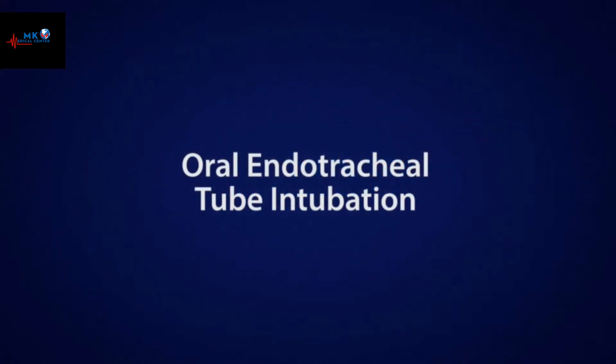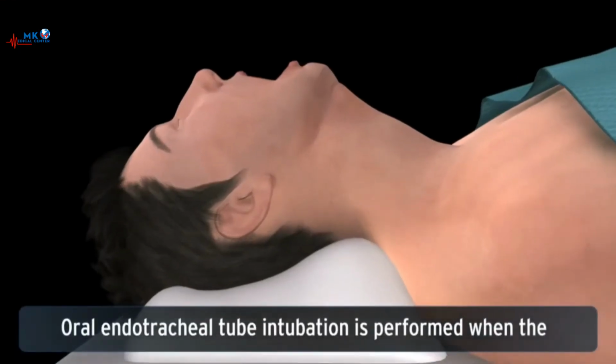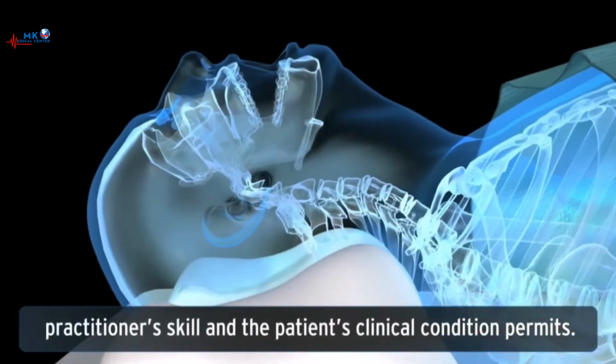Endotracheal tube intubation. Oral endotracheal tube intubation is performed when the practitioner's skill and the patient's clinical condition permits.